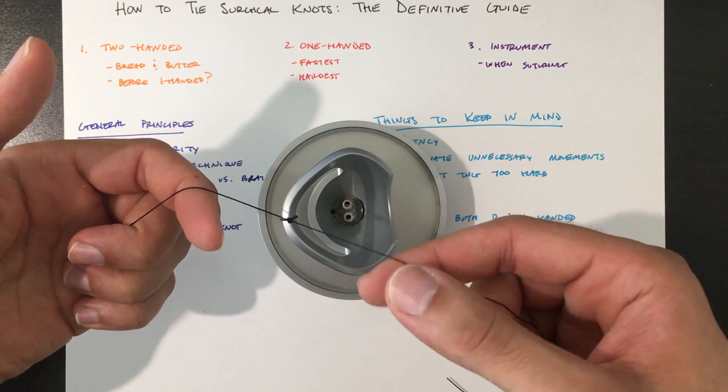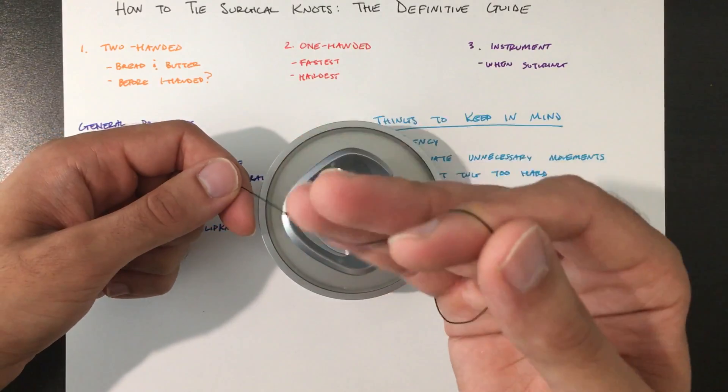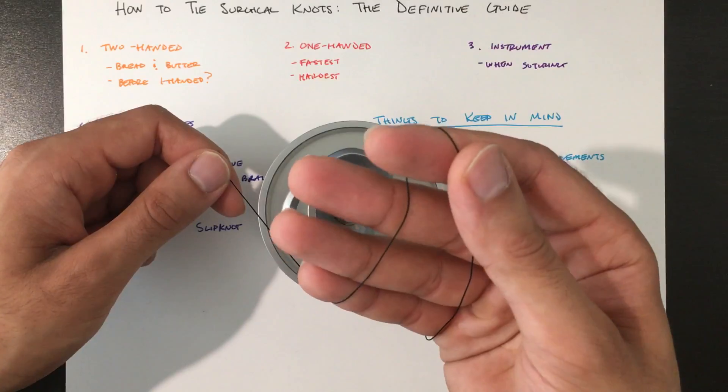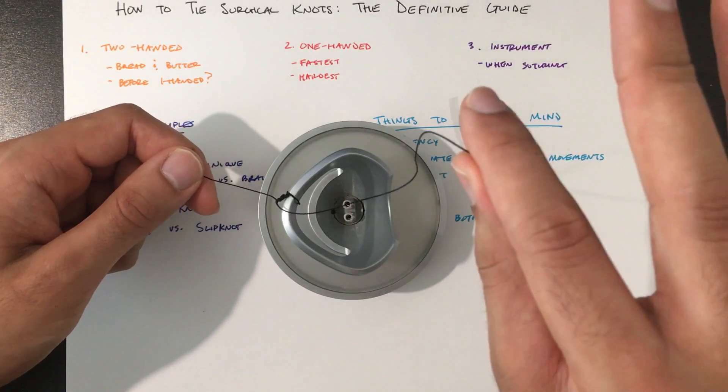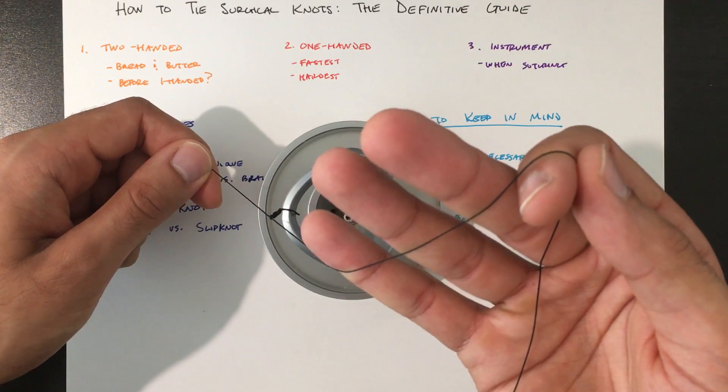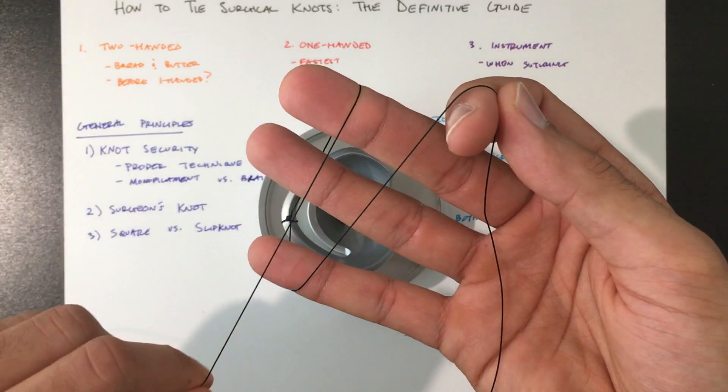So again, start like this, grab these three fingers and put them underneath. So again like this, three fingers underneath, take the other side, wrap it in the opposite direction.